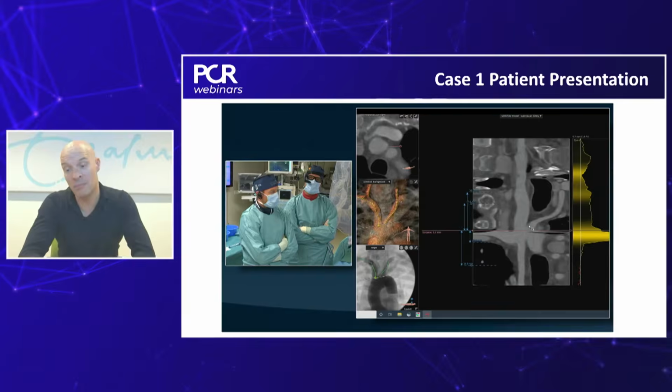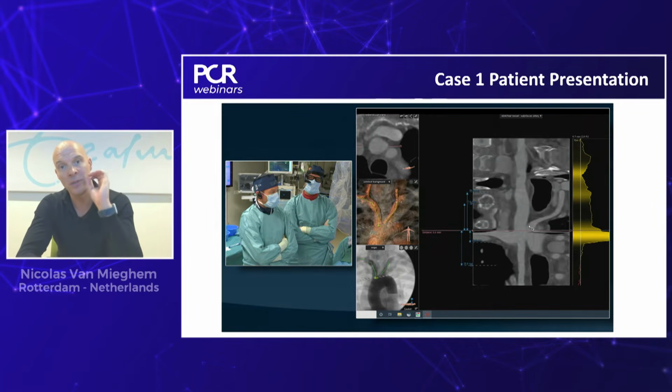Yeah, well, in very thick ventricles, especially if there are kissing ventricles, that would really lean me to the extra small Safari wire. Then I don't think you should need a large bend in your shaped wire, because that will only enhance the risk for pop-outs. So then I would prefer a wire with a very simple and small shape at the end of the wire.